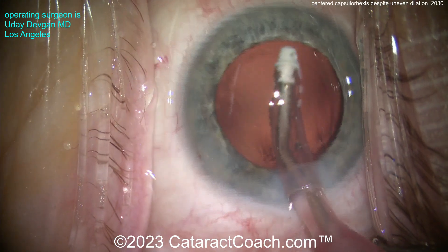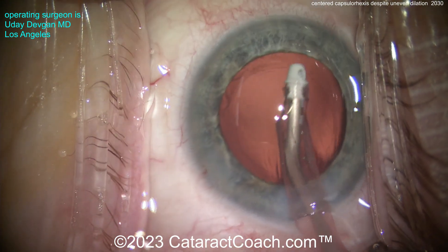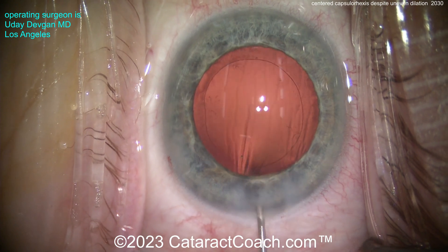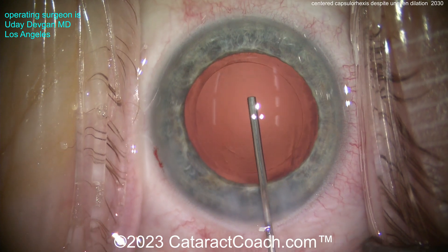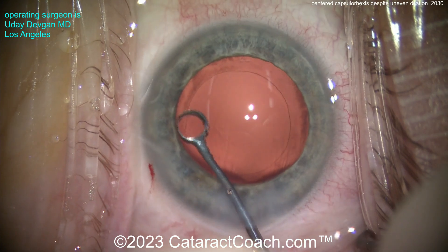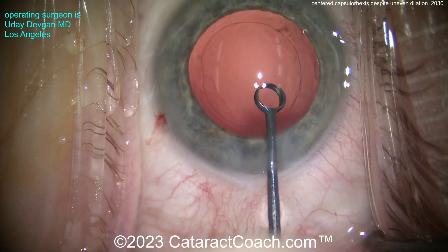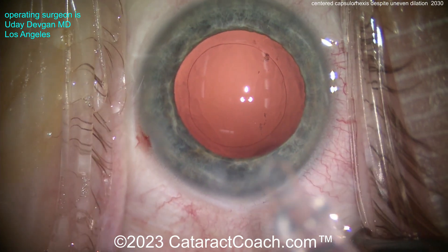So just take out the last bit of cortex here. We're going to polish up the capsule too a little bit — that looks pretty clean though, I like that. And by the way, good draping, eyelid sequestered, no lashes in the field. Here comes the cohesive viscoelastic agent, injecting it in the capsule bag. Nice, good fill. And let's come with a capsule polisher to clean up that undersurface of the anterior capsule just a little bit. Not too much material there, but a little bit of polishing back and forth. You can use any kind of polisher you want, or the I&A probe on a low vacuum level. We've cleaned that little bit of material up.